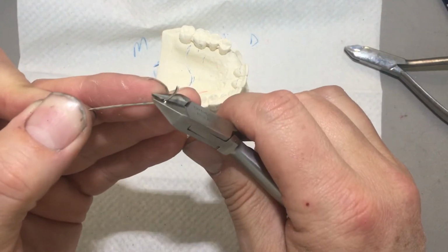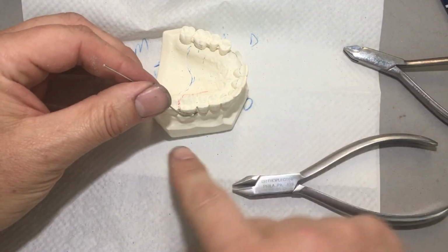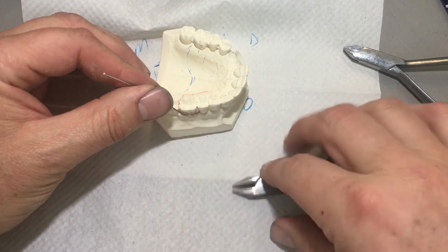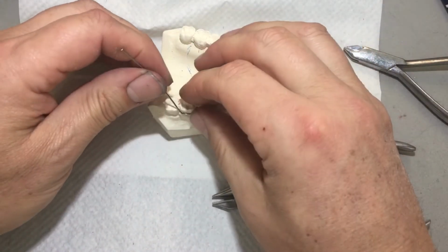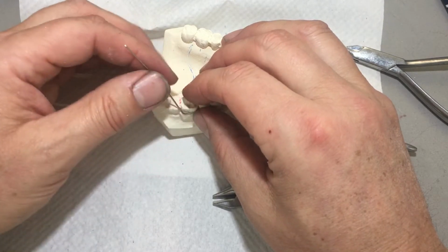And now this I think everyone can do, but we get to this moment here where it's like, well, now I've got to bend it up and over and across the occlusion, and it's not working. I'm stuck in number 1 of Paul's rubrics. I can't do it. I can't get this to go over there.